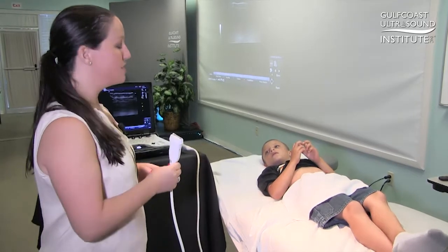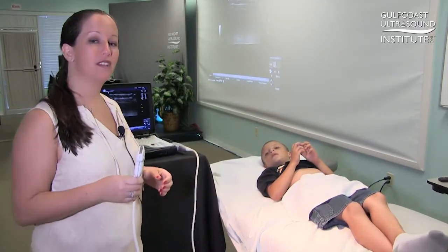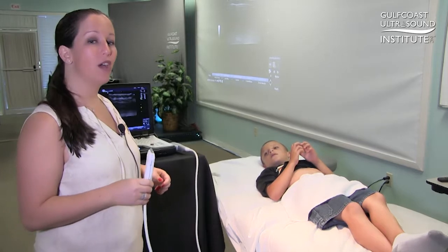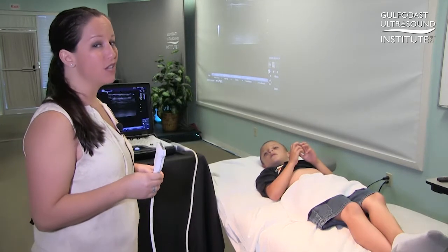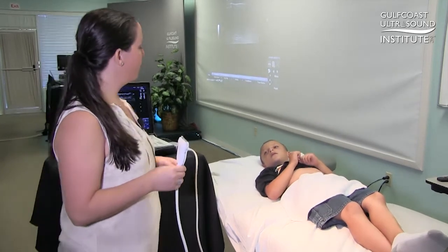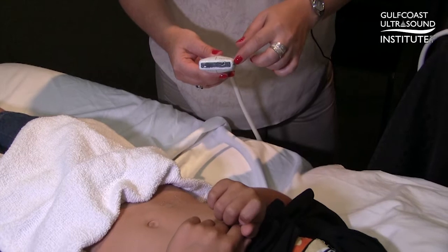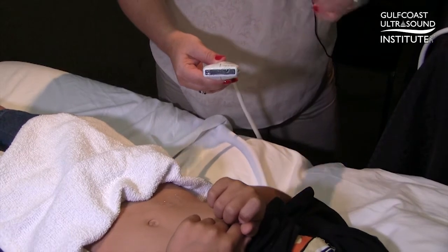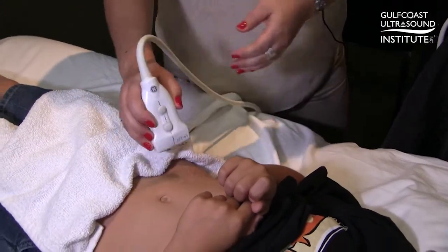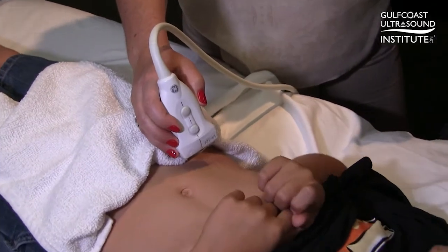Usually when someone comes in with a lot of abdominal pain and you're going to be pressing down on the right lower quadrant, it's helpful to give either intranasal fentanyl, morphine, or even Motrin. When we start scanning, we put a copious amount of gel and we'll start with the indicator towards the patient's right.